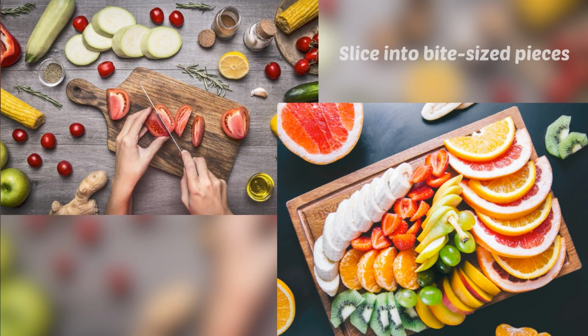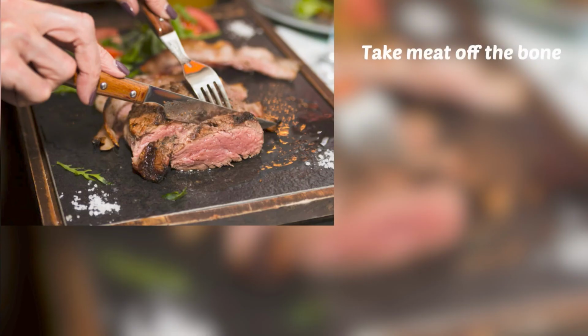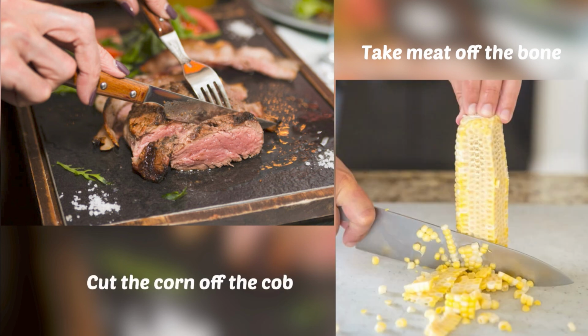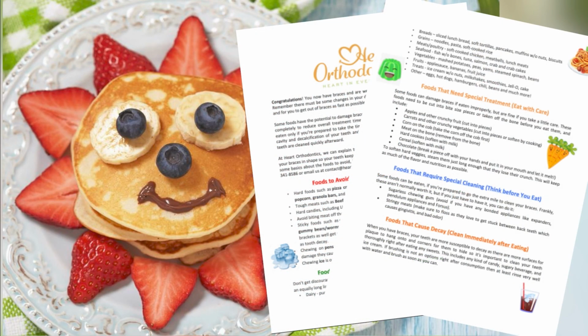Please cut up your fruits and veggies into thin slices or small bite-sized pieces and avoid biting into them whole, as this may break your braces. Meat should be taken off of the bone before being eaten, and the same goes for chicken wings and corn on the cob. A detailed list will be given to you, so please take the time to review that.